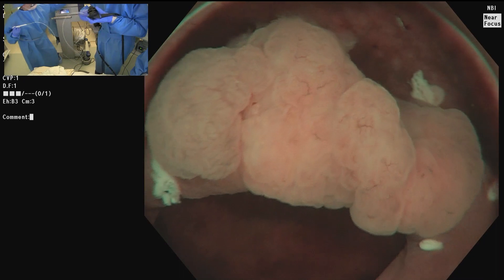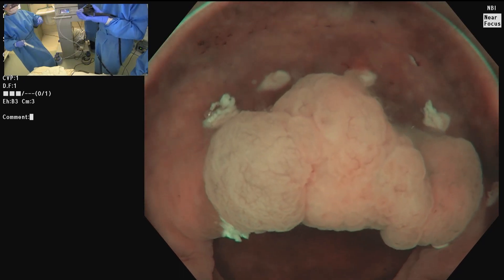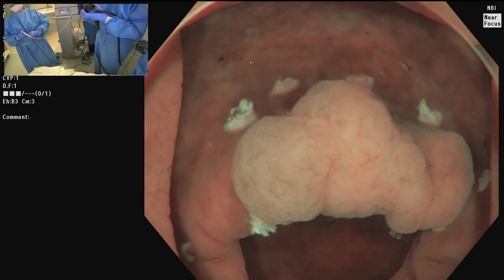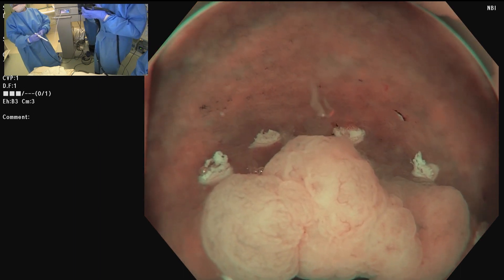That, after all, is the advantage of ESD — that by definition you're getting an en bloc specimen. And if we can accomplish the same with EMR, I think that makes an argument.